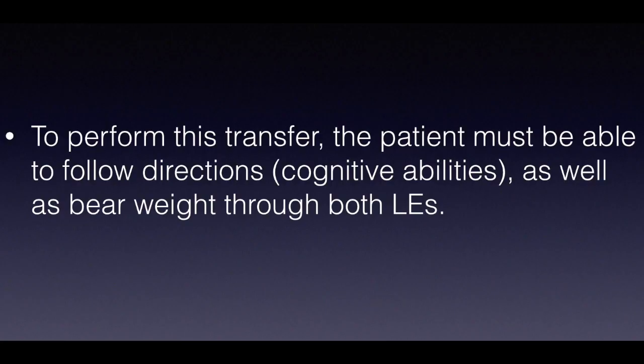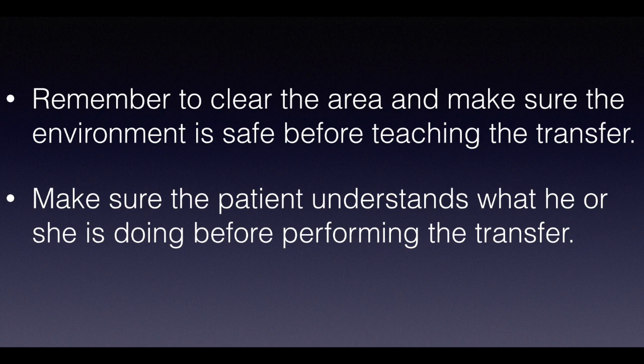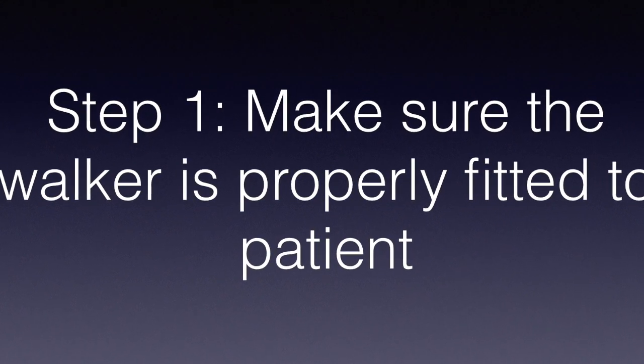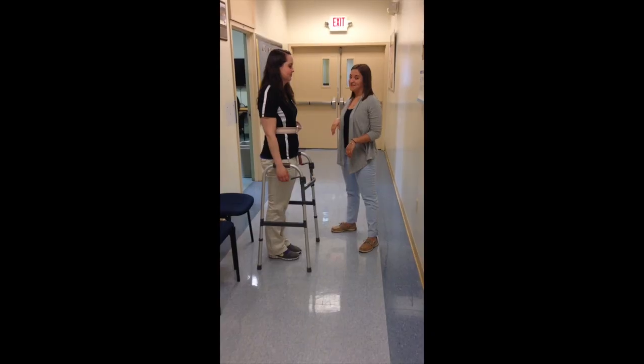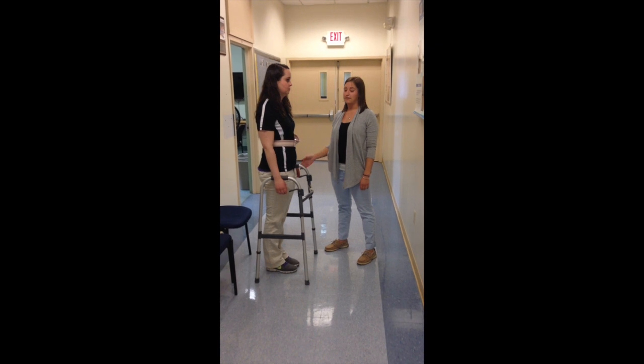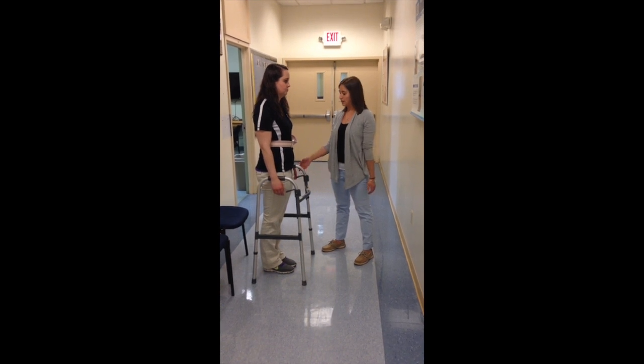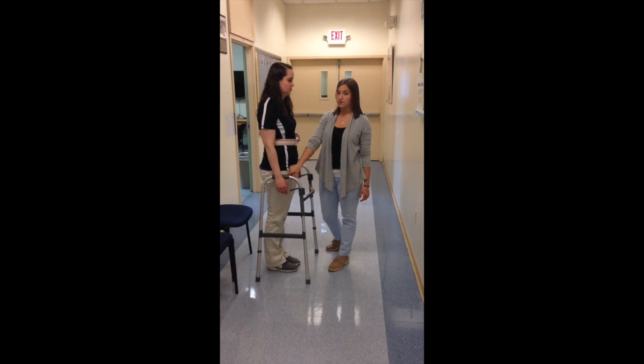Today we're going to teach you how to do a stand step transfer with a walker. Before you do a stand step transfer, you need to first make sure that the walker is fitted to your patient. To do this, have your patient stand up and put their arms down by their side near the walker. You want to look at the wrist crease or at the greater trochanter to make sure that it's fitted.